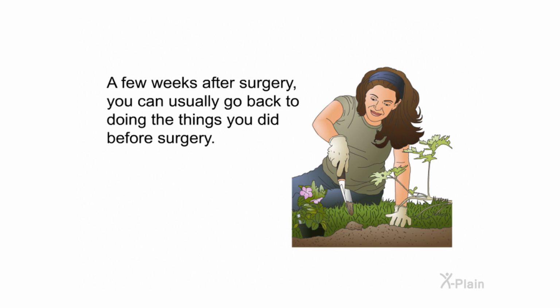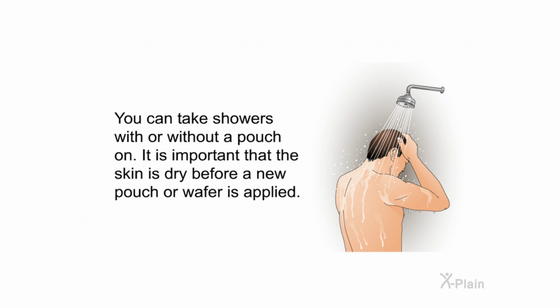A few weeks after surgery, you can usually go back to doing the things you did before surgery. You can take showers with or without a pouch on. It is important that the skin is dry before a new pouch or wafer is applied.